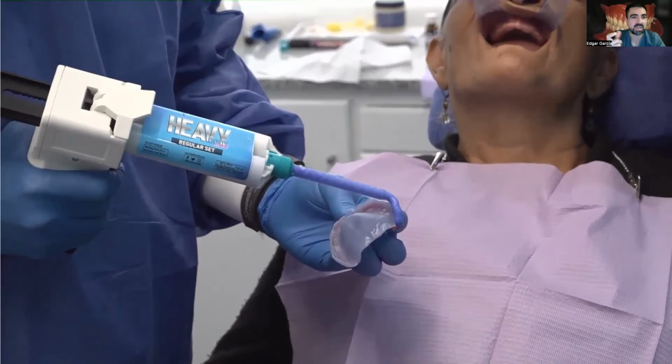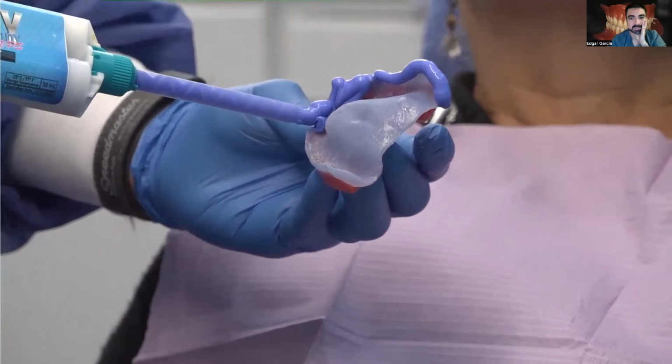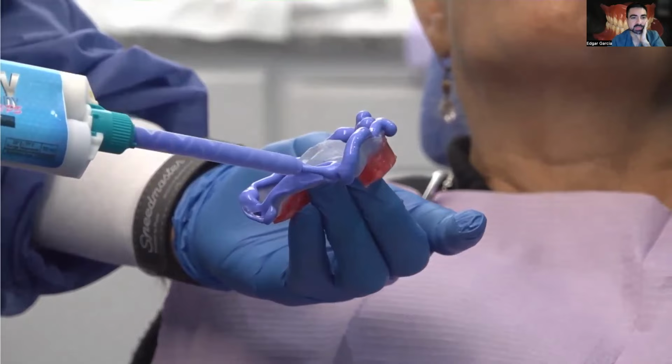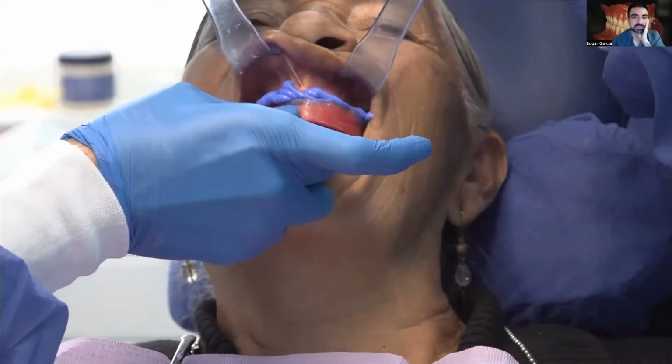Your cast, right? Exactly. So this base plate, in other words, is your final tray, your custom tray. Exactly. You can do it with acrylic or this kind of material that is Triad. And that comes out of the pour of your alginate. So you did an alginate for the upper and an alginate for the lower, and out of that pour you fabricate this. Okay, just like we normally do.